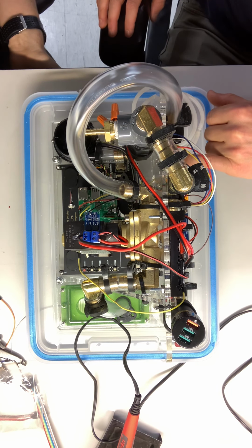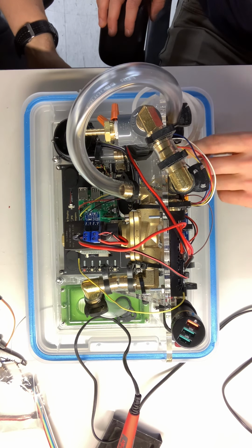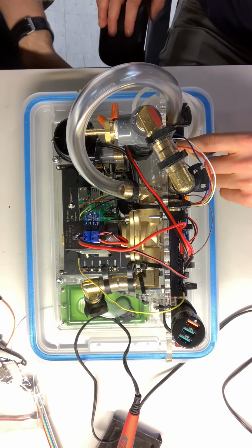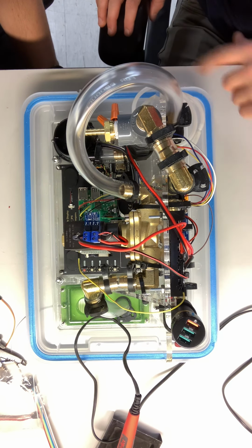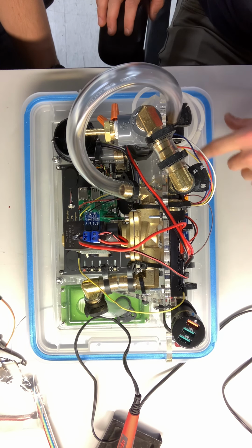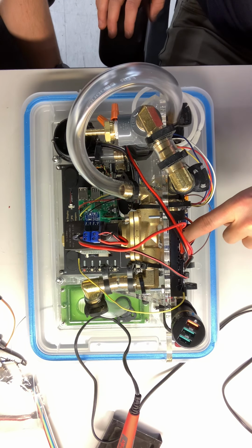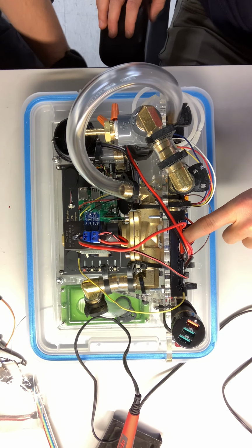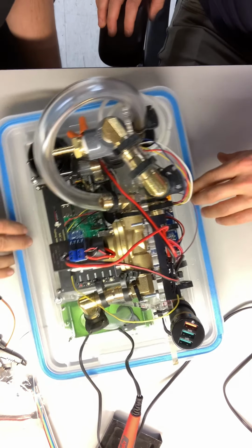So that's going to the high side of this exhale venturi, and the other 2 wires from the exhale differential pressure sensor also go to that venturi, so they're looping around right here. On the other side, the other differential pressure sensor is going around these 2 into the venturi that's up here on the inhale side. Yep. Okay, so that's wiring there. That's tubing then, right? Tubing, yeah. Okay, so that's the wiring of the pressure sensors.